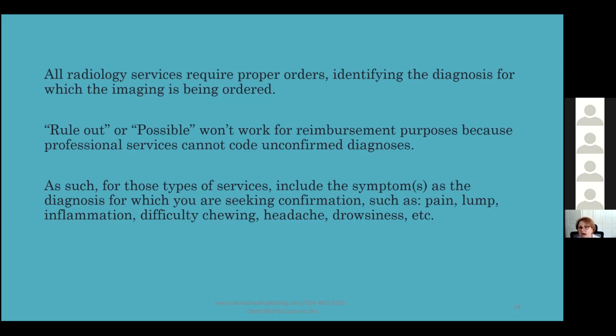And that is how you have to think of everything going on in your practice. Why are you using an X-ray? What's the reason? So you could help diagnose what treatment that area needs. Why is there inflammation? And when you look at the clinical part of the patient, do you really know? Sometimes we don't.